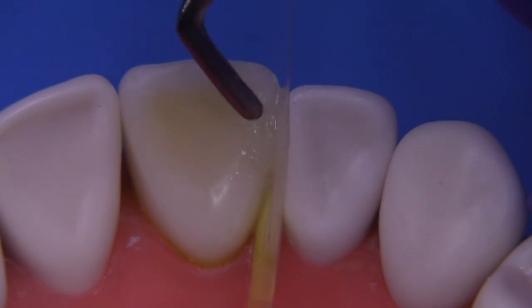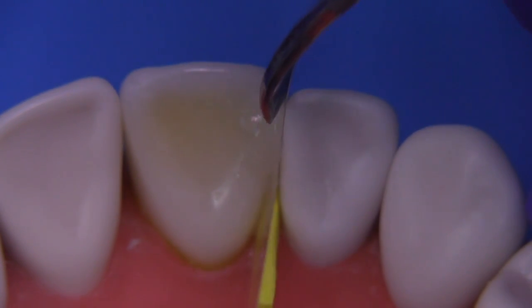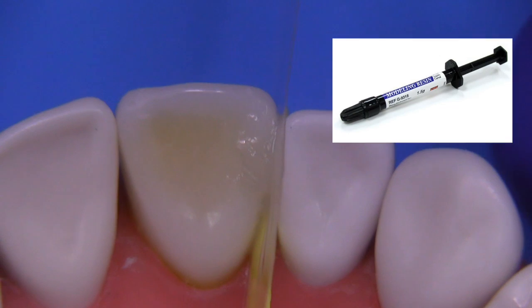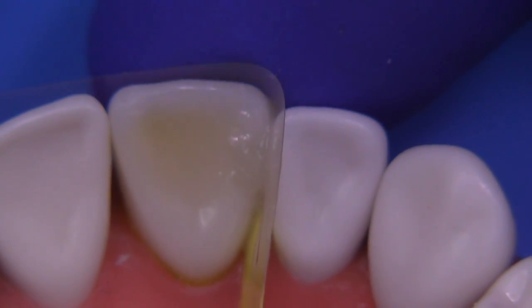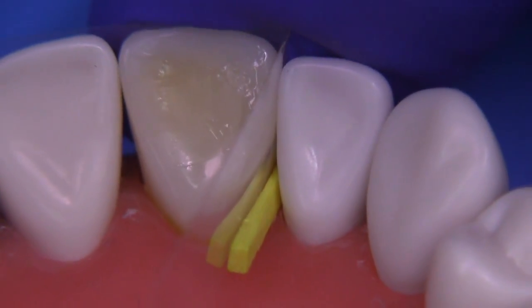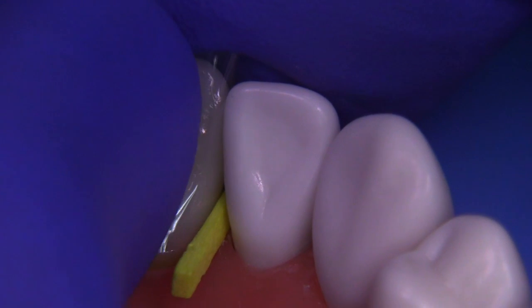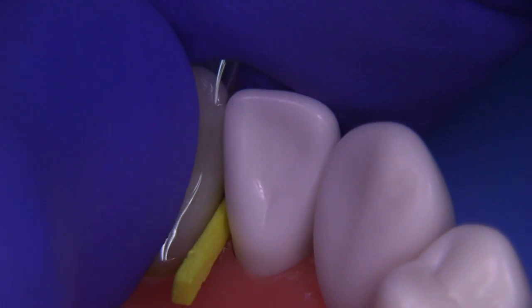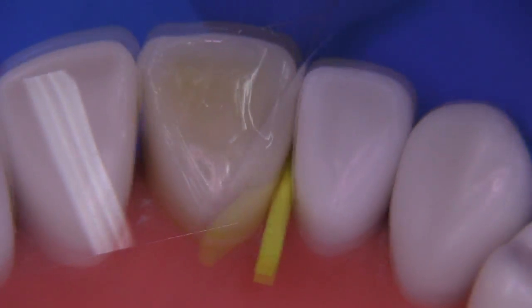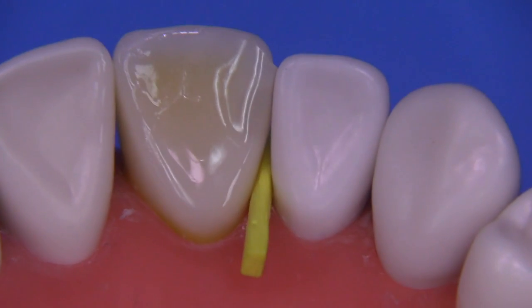If the composite is sticking to the instrument, you can always use a product called Modeling Resin by Bisco. Other companies make a similar product. What these do is they allow the instrument to manipulate the composite without sticking to it, and they don't in any way diminish the hardness or the quality of the composite surface. Look how well this composite will flow into the plastic matrix area by utilizing the snowplow technique, where you're injecting and allowing the adhesive to flow out rather than pre-curing the adhesive. It's a magical thing to see.